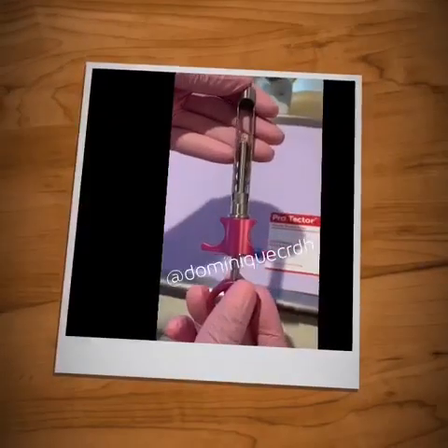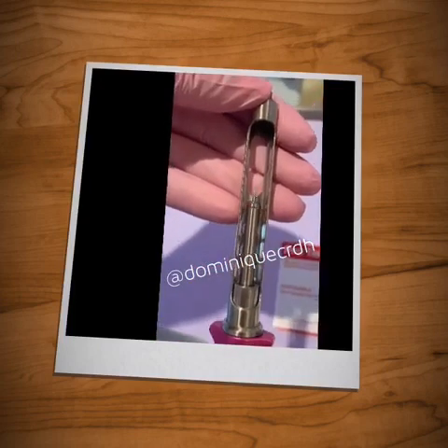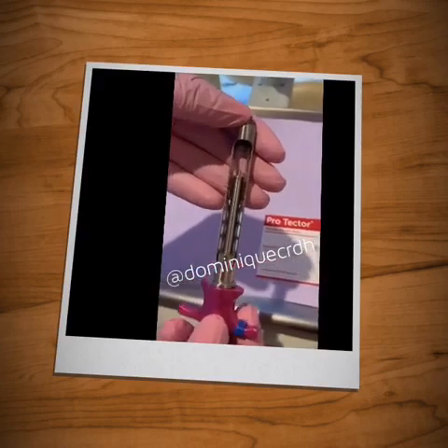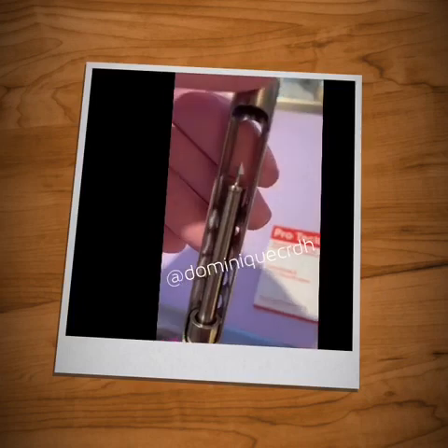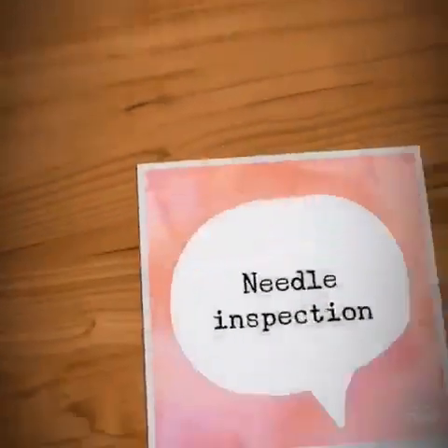The next step I do is actually inspect the syringe itself, looking through the window, to make sure everything is clear, the harpoon and the piston are intact, and, looking closely, everything looks like it's functioning properly. So it looks like we are ready to load the syringe.